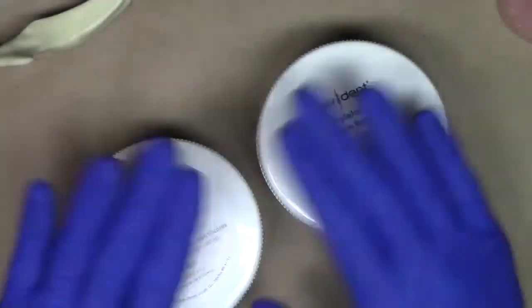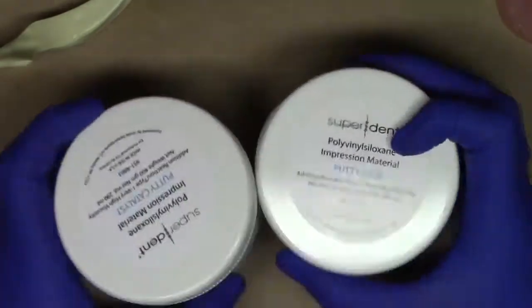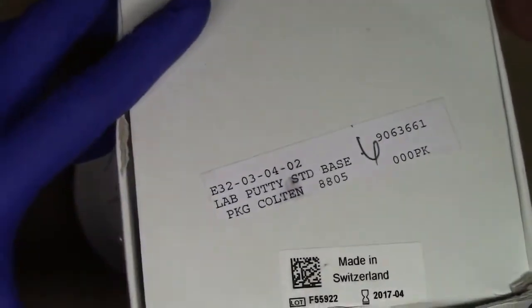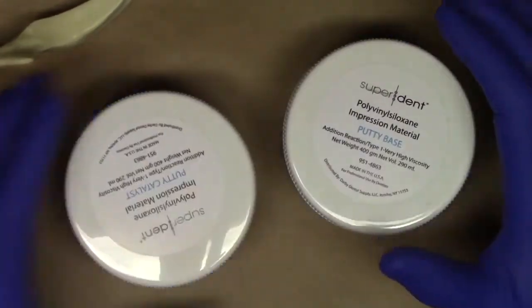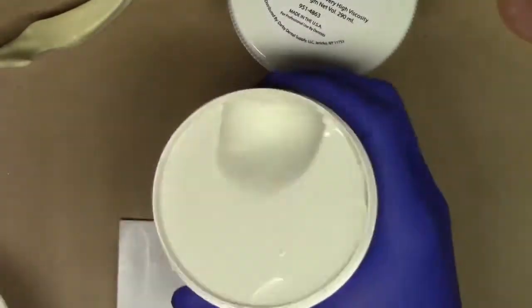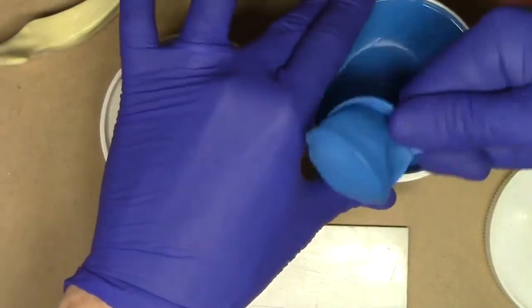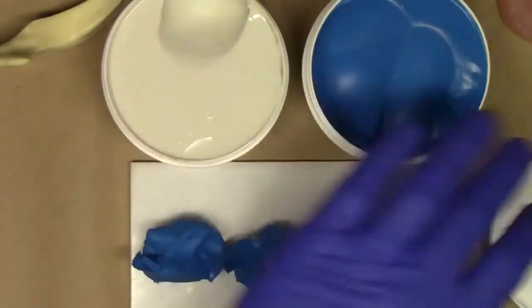So at this point, what we're going to do is take putty. This is just showing you some generic type of putty, a very inexpensive clinical putty, or you can utilize laboratory putty that's commercially available through any supplier. This is just showing you more of a clinical putty for simplicity purposes. First step is we take our putty and we measure out 6 scoops. So a total of 3 base and 3 catalyst.